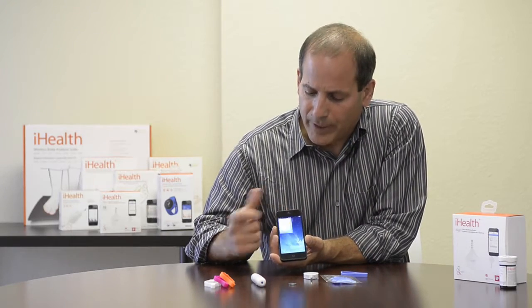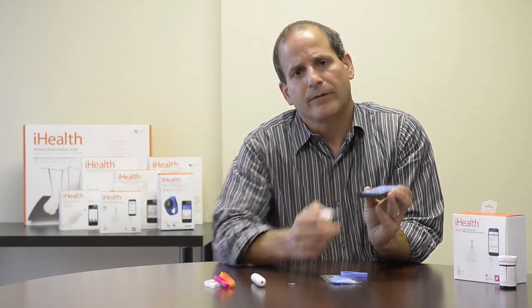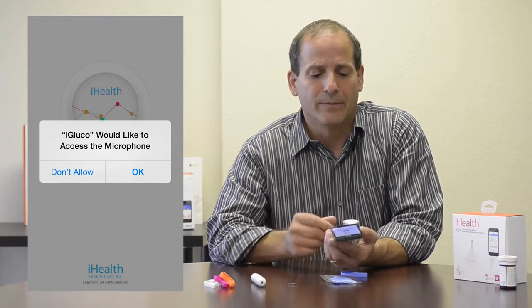I'm going to go ahead and open up the app, and once it's open, I will insert the meter into the phone jack on the bottom of the phone. When I insert the meter the first time, it's going to ask if it has permission to use the microphone. Say yes — that's the app getting permission from the phone to use the phone jack to take a measurement.